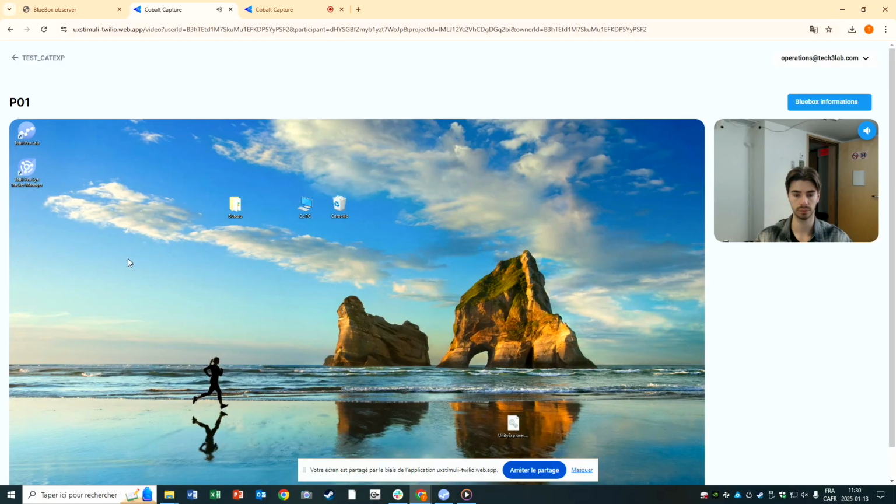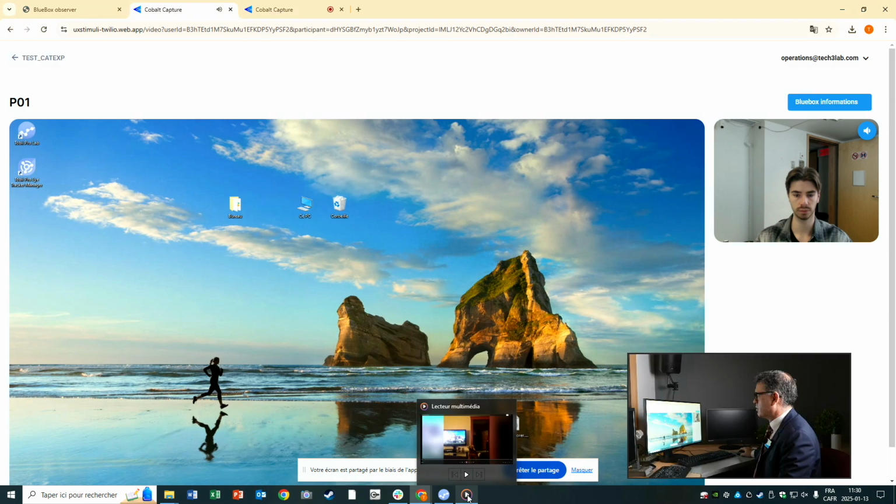There's nothing else we need to do. I have my video here. You see it's a video tab. I'm going to show it to you.